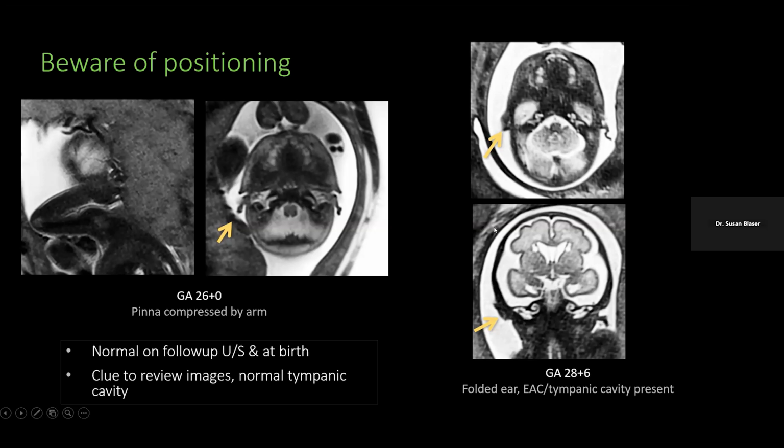Well, how do we know to look again? Well, let's take a look at that tympanic ring and those structures. So not even going back to this one, but looking at this one, yes, you've got a normal pinna on one side, a folded over one on the other side. When you're taking a look at your cochlea, there you are here, ossicles, tympanic recess, and the structures of your middle and your inner ear are normal.